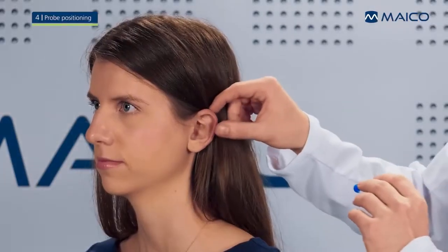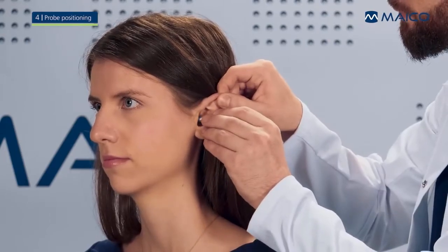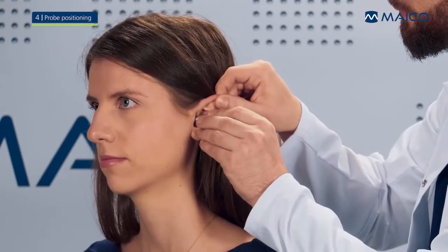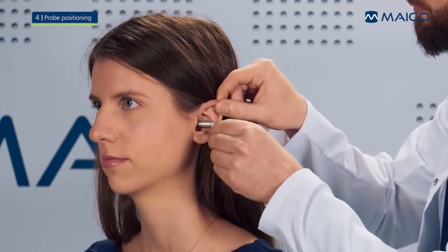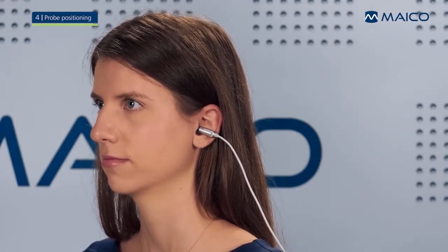Place the probe gently and securely into the patient's ear canal. It is easier to place the probe correctly if you carefully pull the patient's ear back and upwards so the ear canal is slightly straightened. Make sure that the probe is inserted deep enough so it does not fall out too easily.